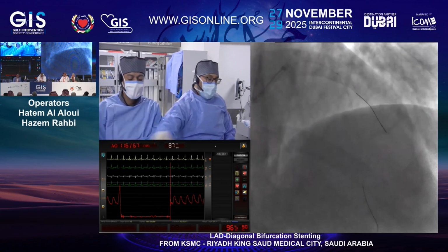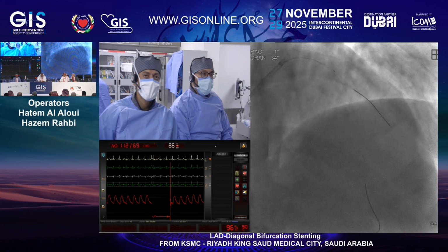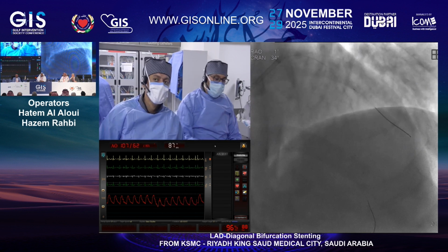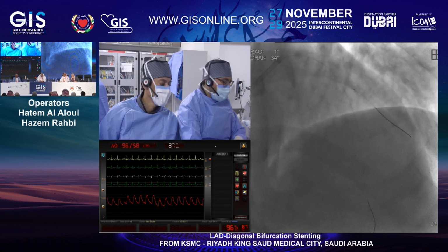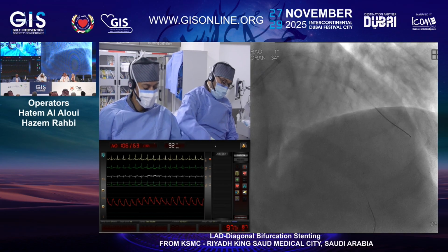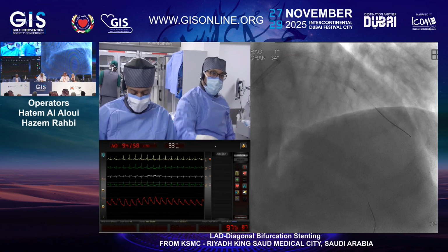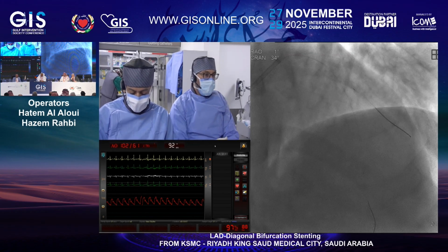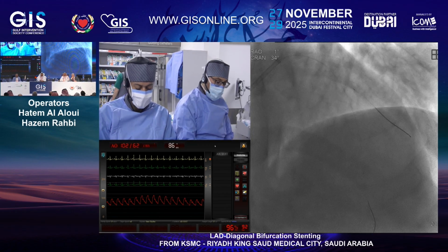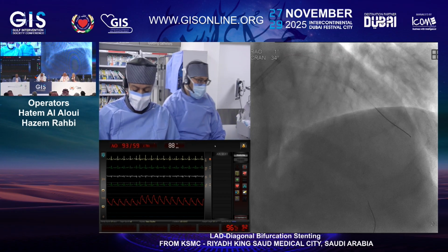Yes. On the contrary, with the positive remodeling we know that these lesions are more unstable, more vulnerable. So I really don't want to go high pressure to manipulate too much there. We have learned that very hard in STEMI. When you have a bifurcating lesion, you have an excellent result of your bifurcation stenting, and at the end you go aggressively with an aggressive POT and you destabilize everything and you have a no-reflow. So even when you do an OCT, always the proximal part is very vulnerable.